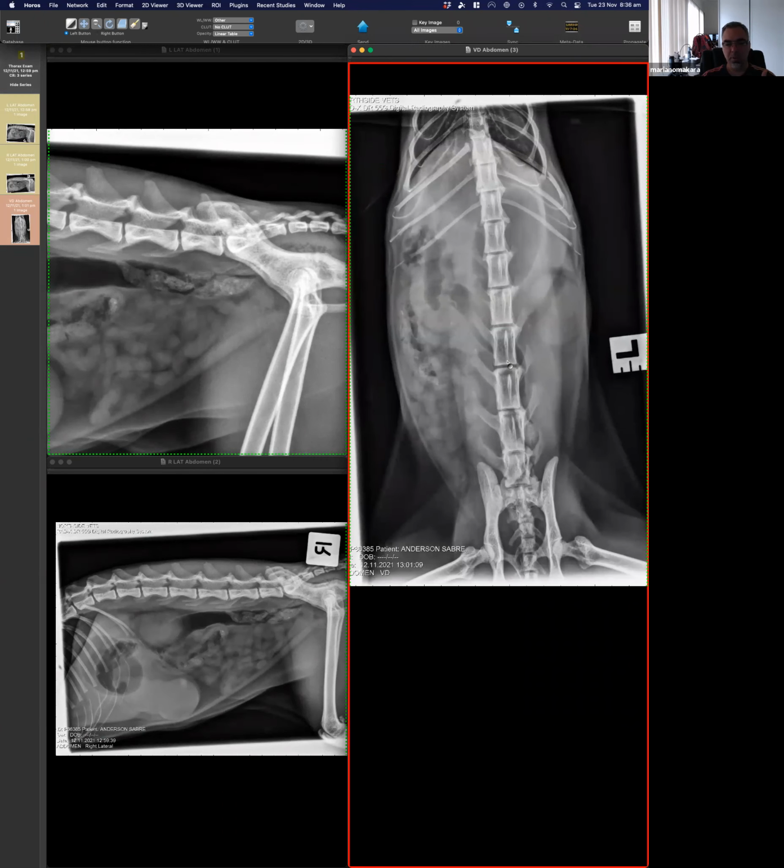I think it's not only displaced to the right, but it's caudally displaced by the stomach. So that's one point. Why is it to the left? Helen's comment that it is a little bit oblique. We like to blame obliquity for many things, so I take that one. It is minimally oblique. And the third one, which I think is the answer, is that cats are weird, and anatomically we know that cats do this.